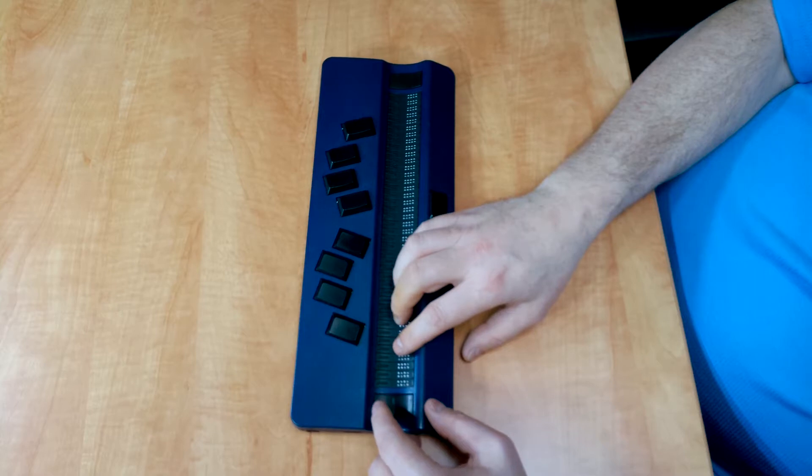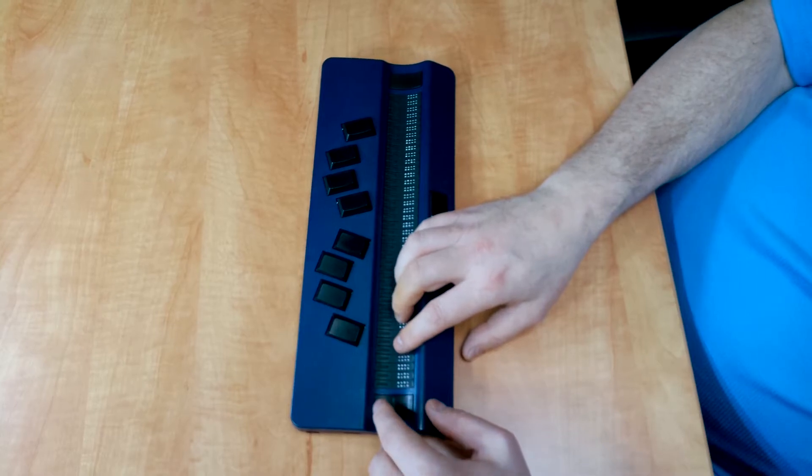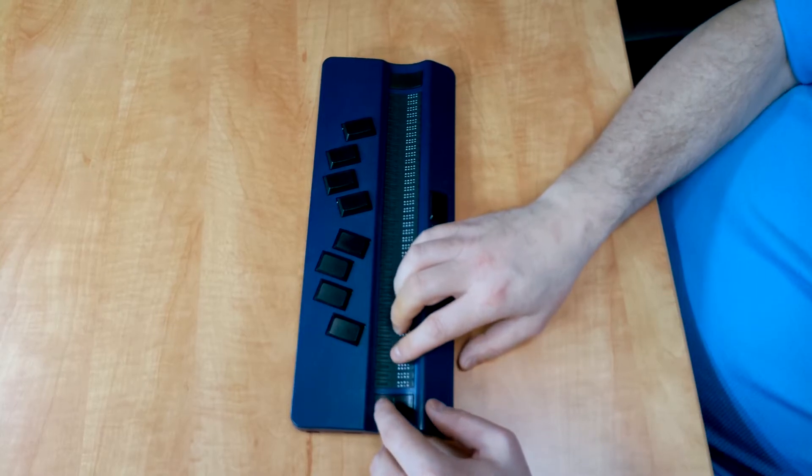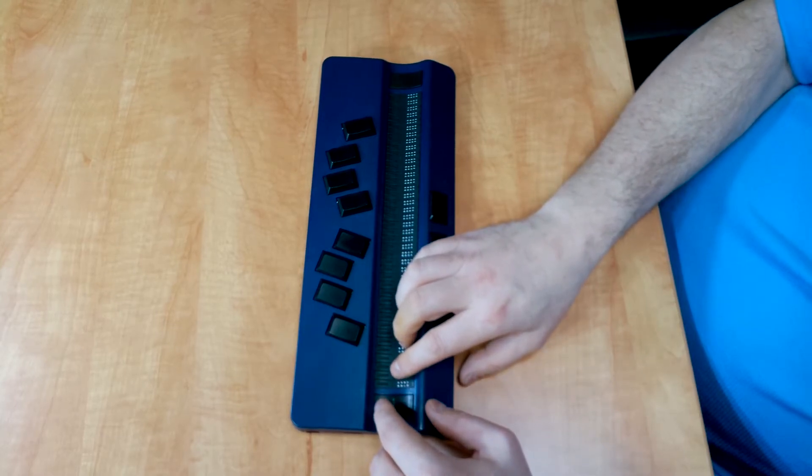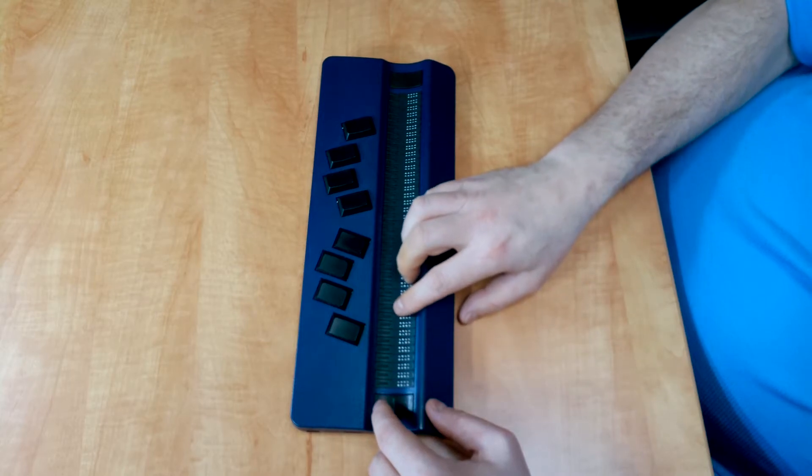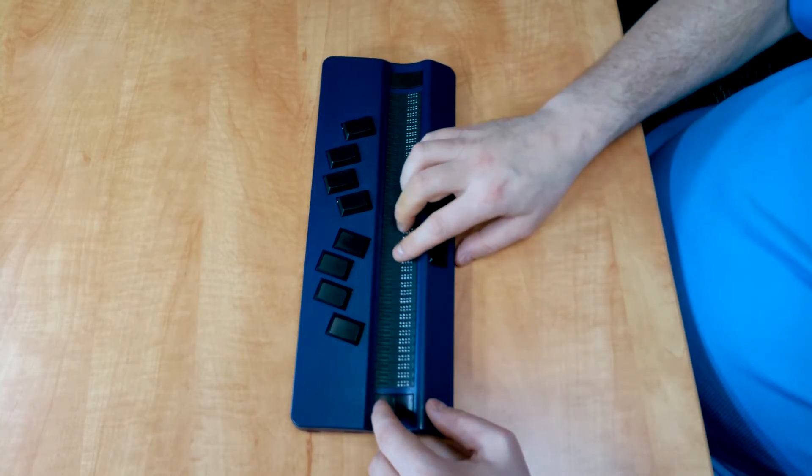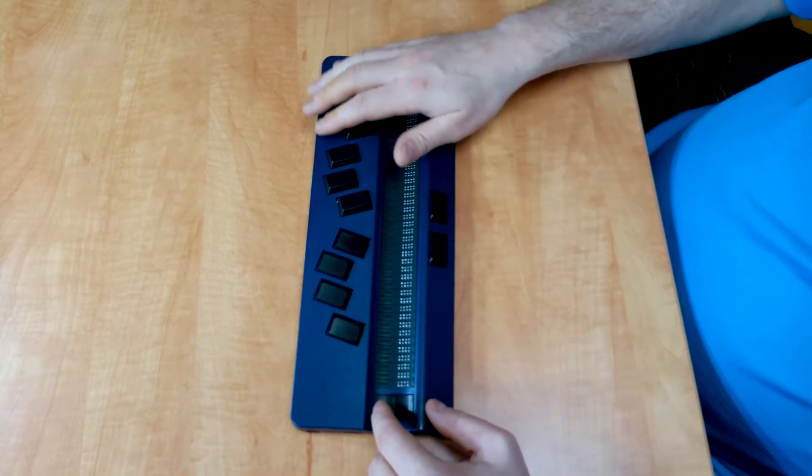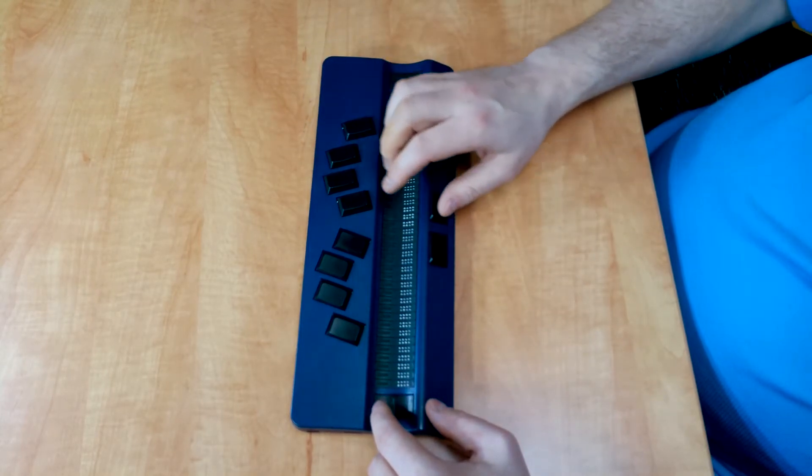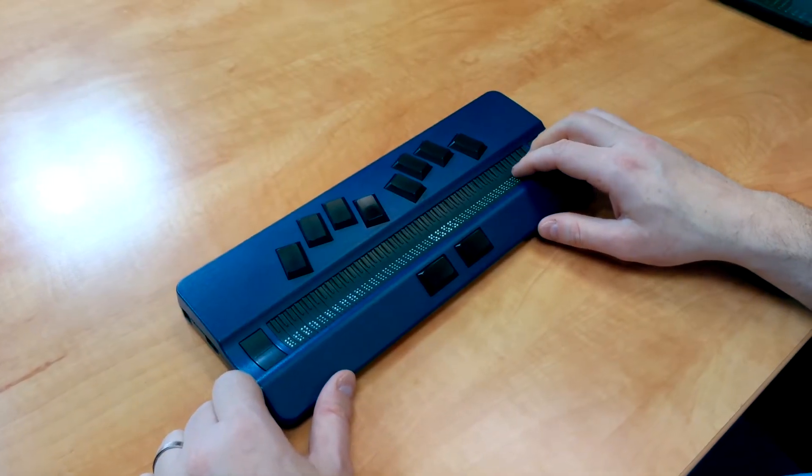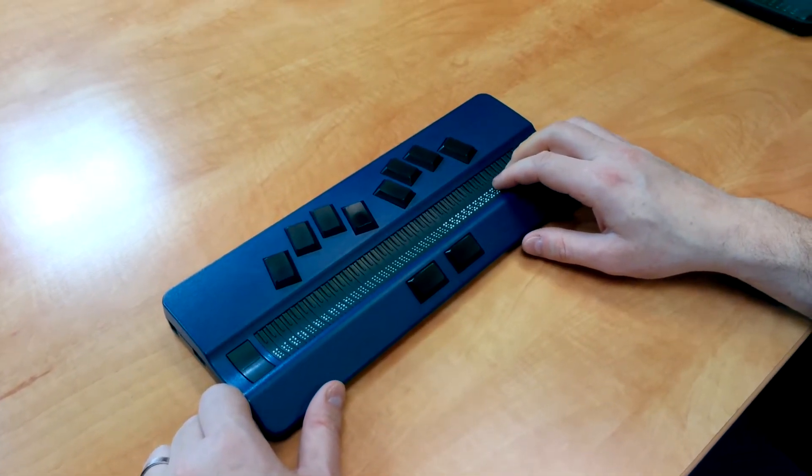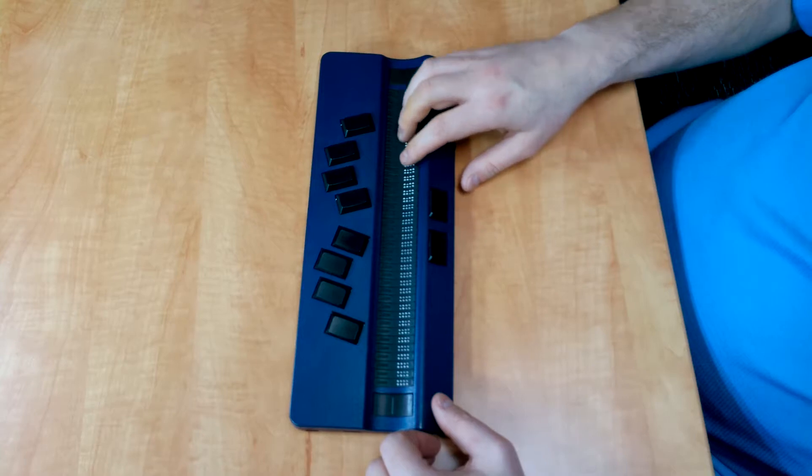We're going to scroll back up now to Bluetooth Pairing. Once you see the Bluetooth Pairing option, press Enter. And on the right hand side of the Braille display, you'll see the cells start to scroll from left to right, up and down.